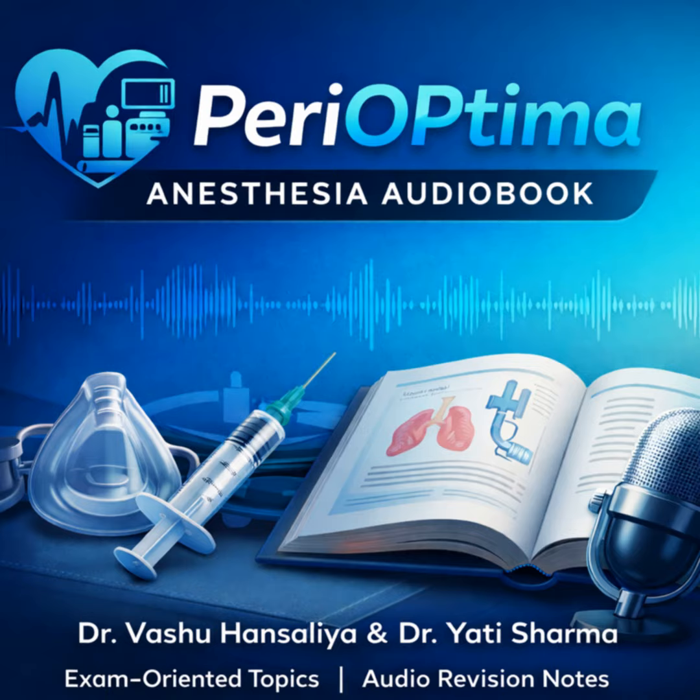The second is the image bundle. This one is coherent. So every fiber has to be in the exact same position at both ends. The exact same spatial relationship. This is what transmits the high-res image back to your eyepiece or a video chip. And if a single fiber in that coherent image bundle breaks, you get a little black dot in your vision, a fixed, small black dot. That's a key troubleshooting point to mention. If a light source fiber breaks, the image just gets dimmer.